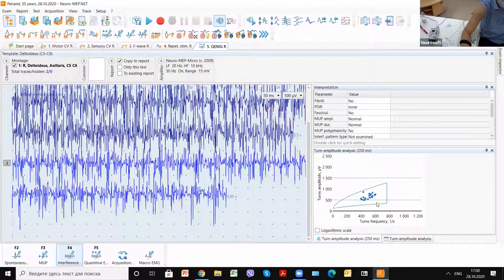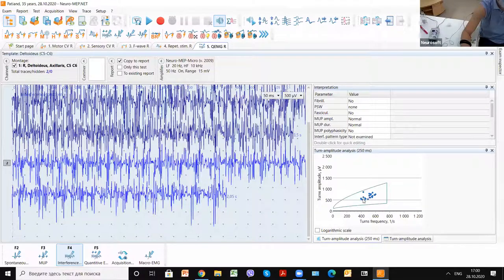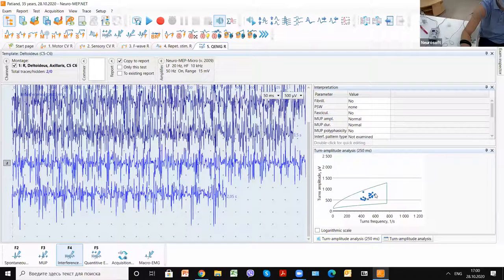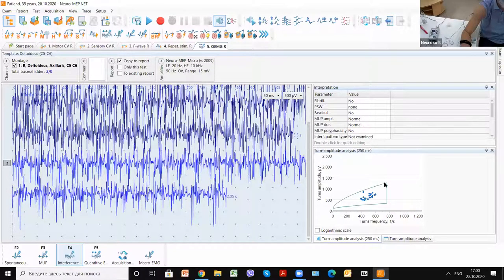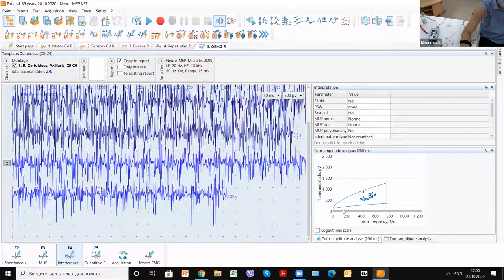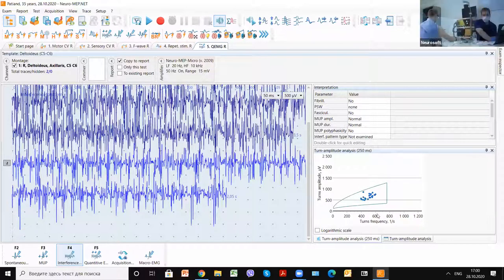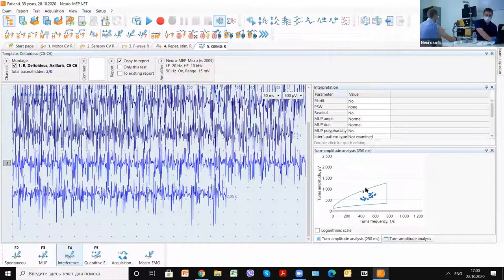And we estimate turn frequency. Usually it must be in the special frame. It's connected with normal values. We can see it's absolutely normal.